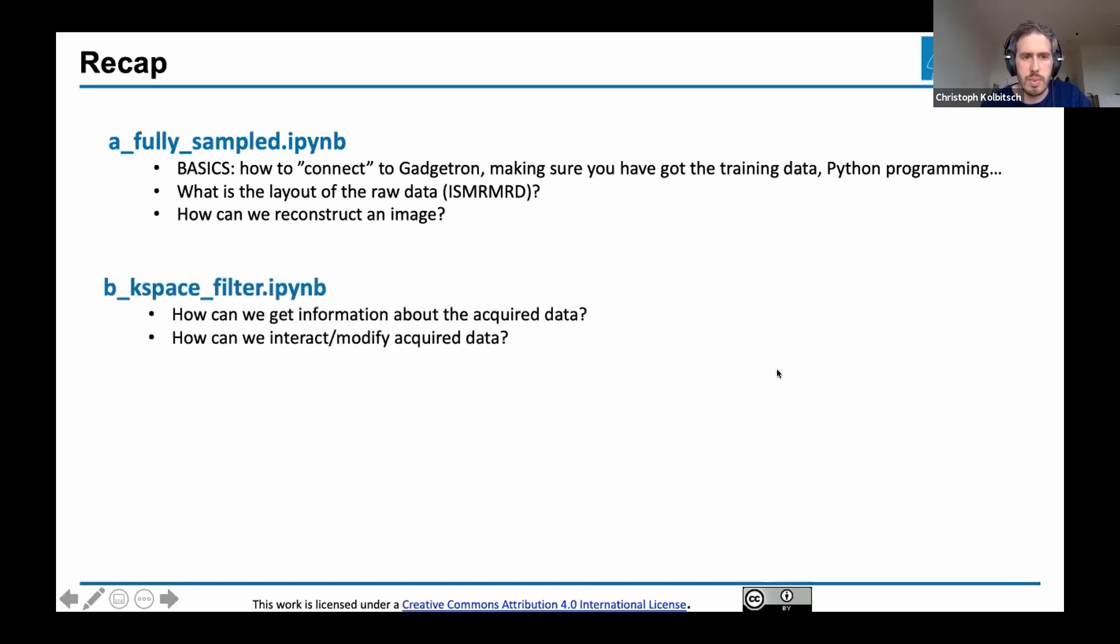We also had the k-space filter notebook. The main learning objective was to see that you can interact with the raw data, not at each iteration of an algorithm as Chris showed, but along the reconstruction pipeline. We used Gadgetron to read in the data, got our raw k-space data, modified and filtered it, then passed it on to Gadgetron for reconstruction.